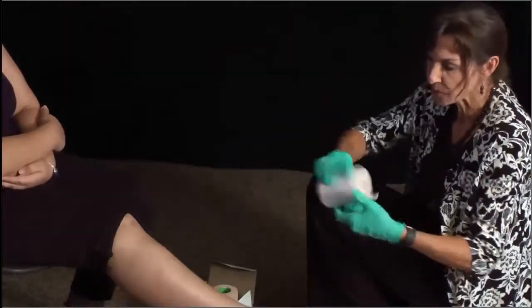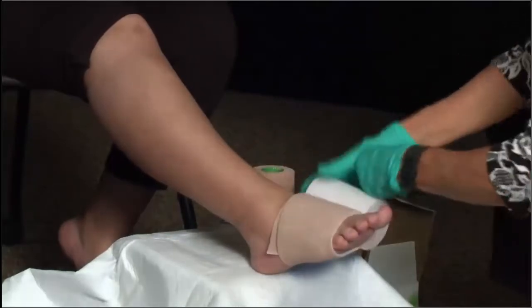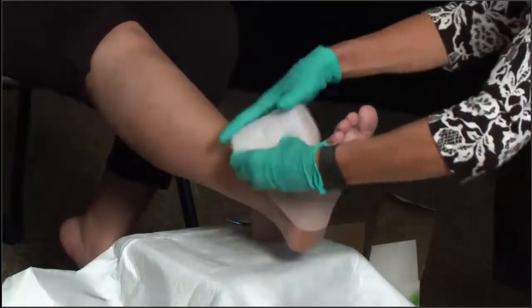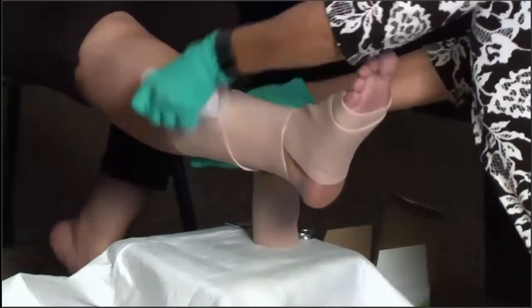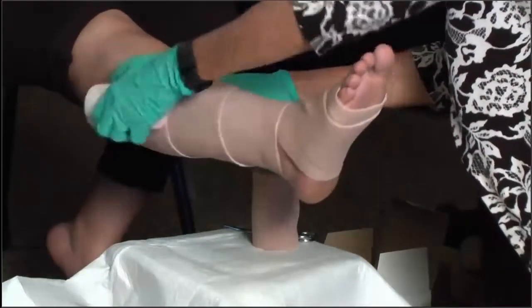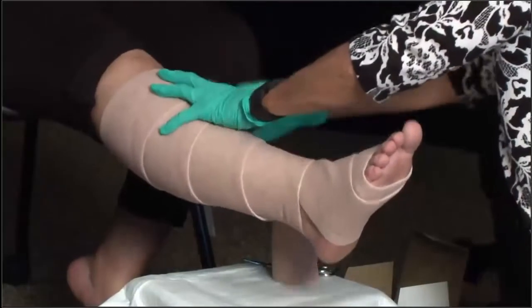In order to do this, I'm going to start at the base of the toe with my first wrap, and I am basically going to come around a couple of times. Then I am going to ask my volunteer to flex her foot. We just continue to go all the way up and around, doing a 50% spiral overlap. And that should do it for the first layer.